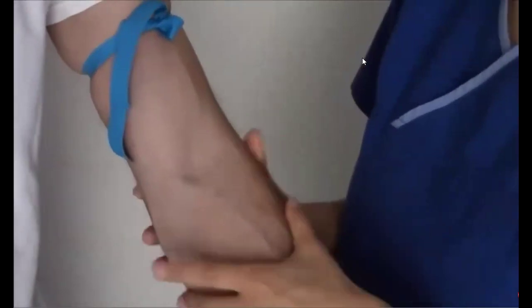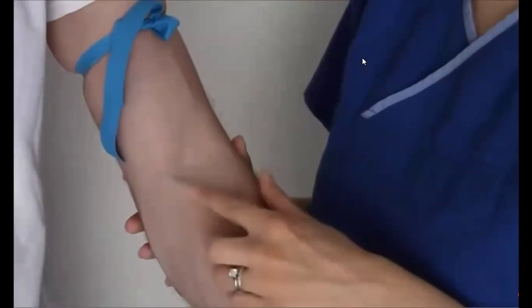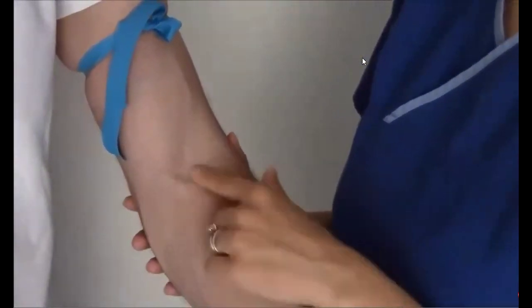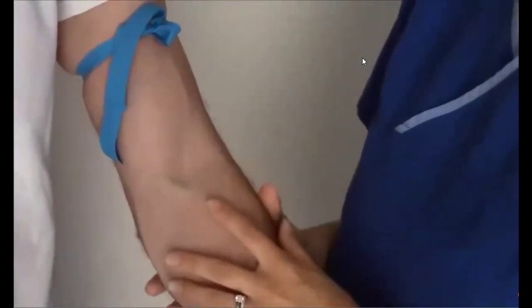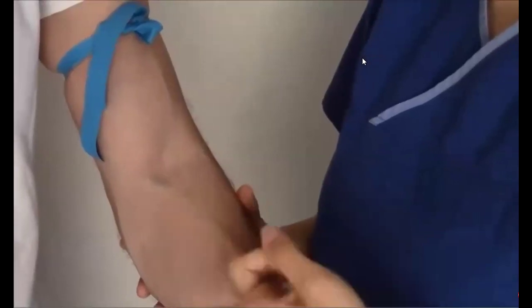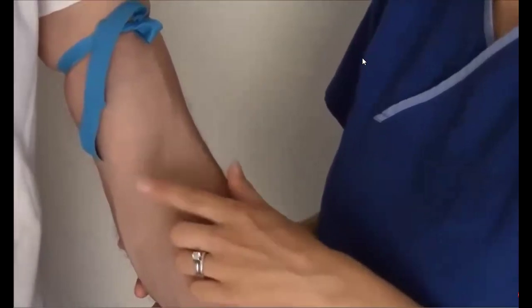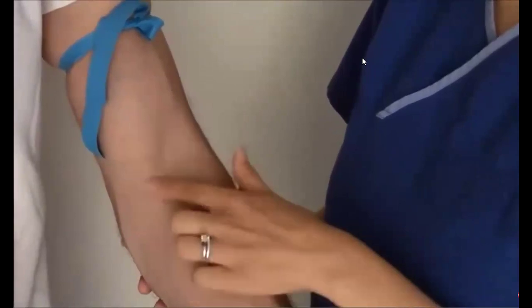A key, some people are seers. They can see the vein and they poke it. I'm a feeler. I have to be able to feel the springiness of the vein. It tells me a lot about if the vein rolls, how large it is, and the placement of it. So if you're a feeler, what you need to do is take your index finger and always feel the vein. Veins have a unique feel to them. Compared to if you're feeling the skin, it doesn't feel like a vein.